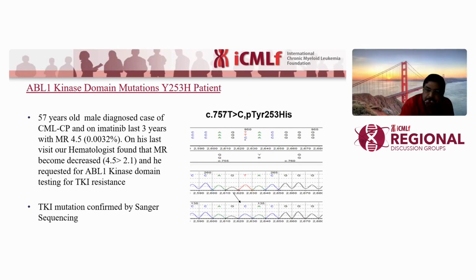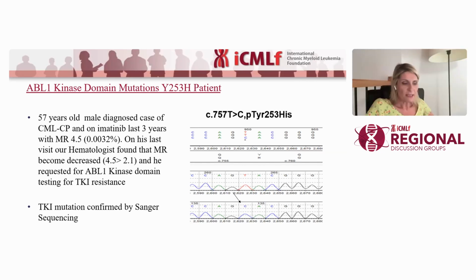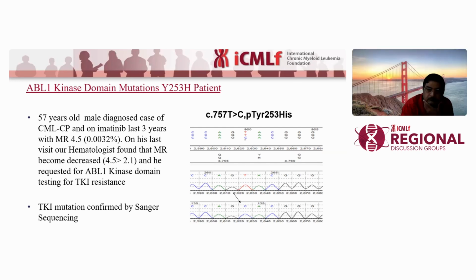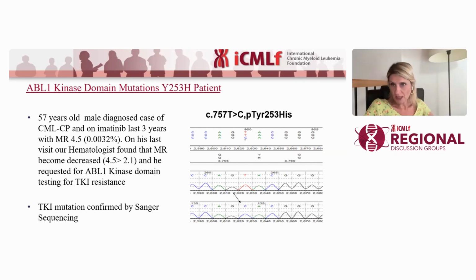You nicely presented the advantages and disadvantages of Sanger sequencing versus NGS. First of all, I would like to underline that the issue you mentioned regarding low transcript levels, the problem of detecting mutations at lower transcript levels, is not only an issue of Sanger sequencing but similarly an issue for NGS.